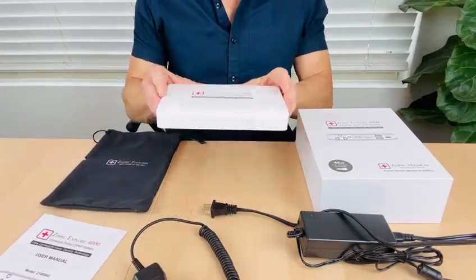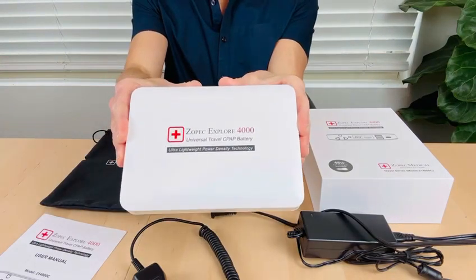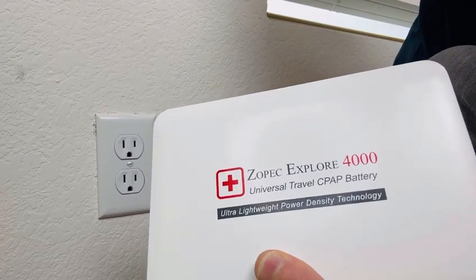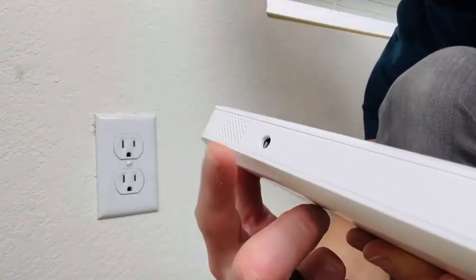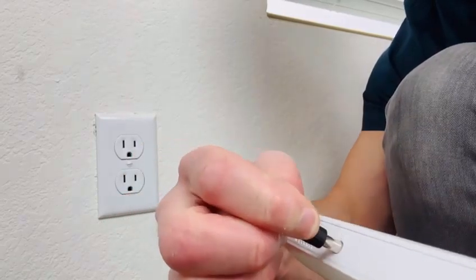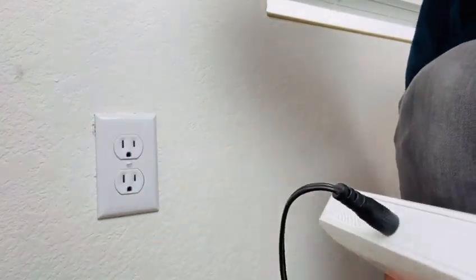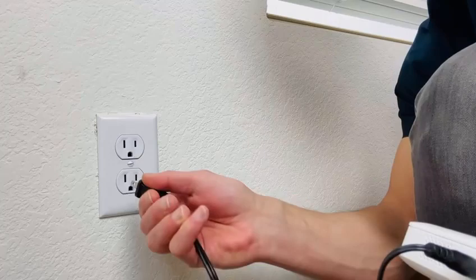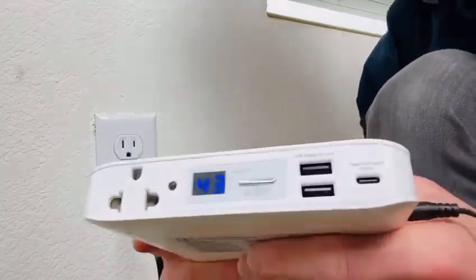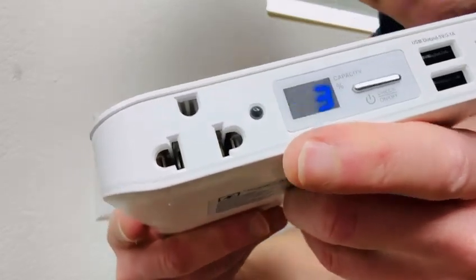With me I have the Explorer 4000 travel CPAP battery. Before using, it is always recommended to fully charge your battery. Simply plug the round pin end of the power adapter into the charge port located at the side of the battery and the other end to the electrical wall outlet. The digital screen will start blinking with the battery life percentage to indicate it is charging.